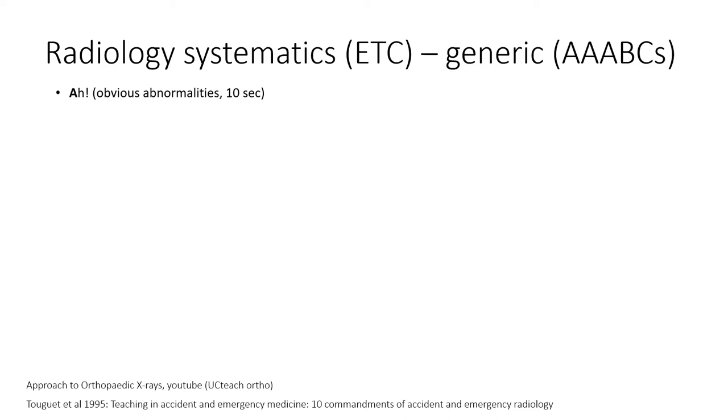So for any X-ray, this is musculoskeletal, and it's just generic. There are subtleties in each area that I will not go into, but I might show you some of them through this lecture. But first of all, obvious abnormalities. You'll just check for those.